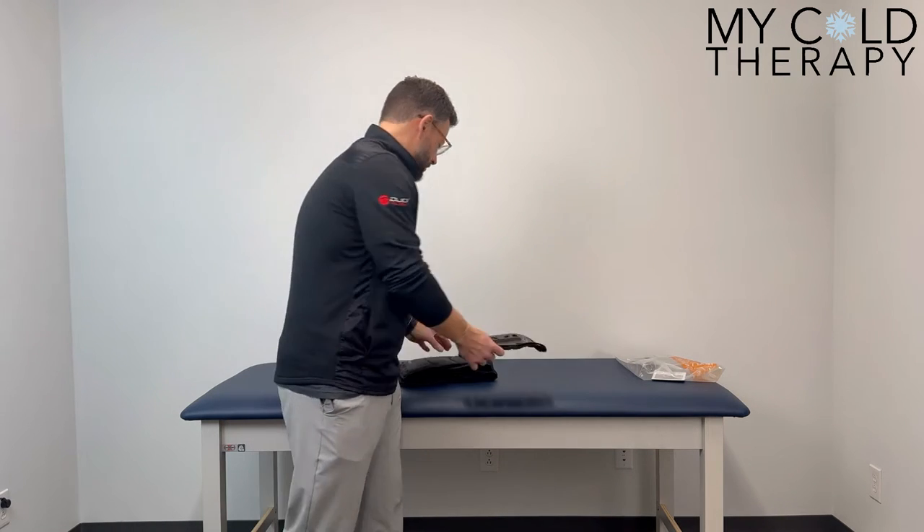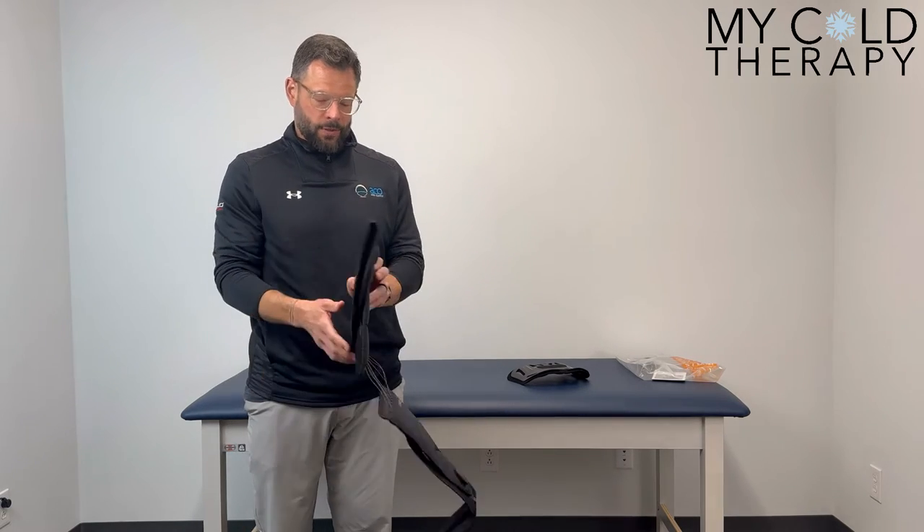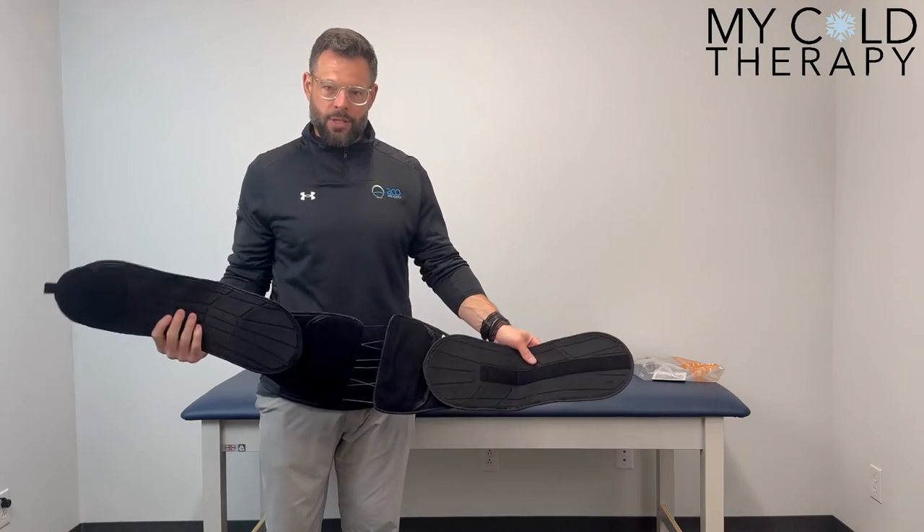This velcro portion right here is eventually going to velcro and the brace will walk you through that. The other portion you're going to receive is your corset. Your corset itself is going to be velcroed together — we're going to open this up.